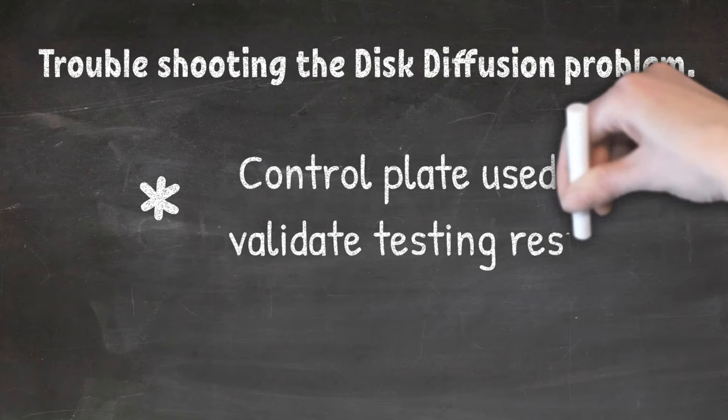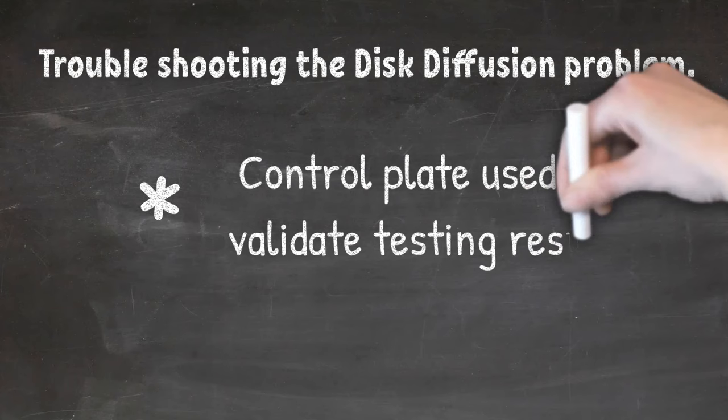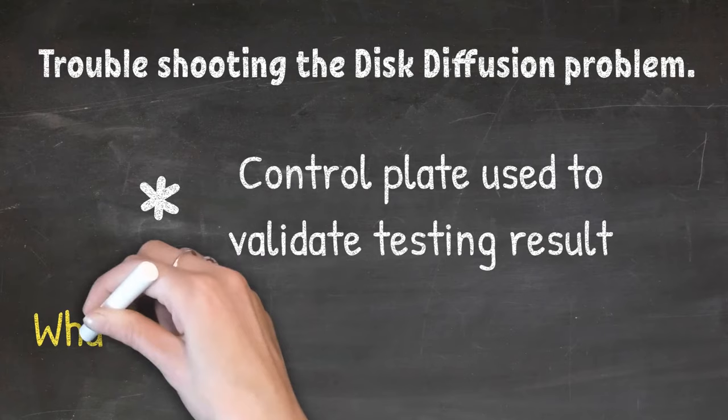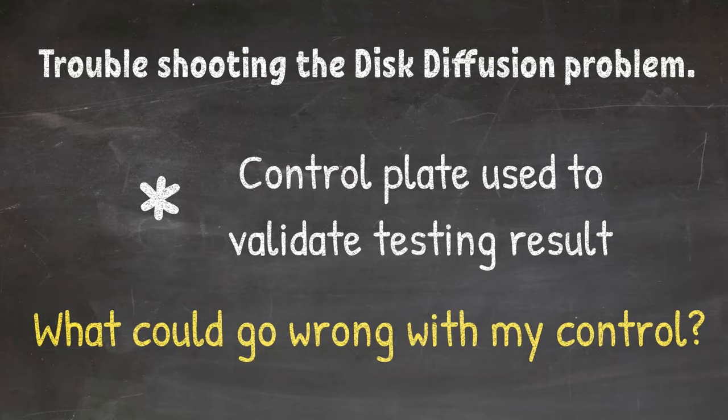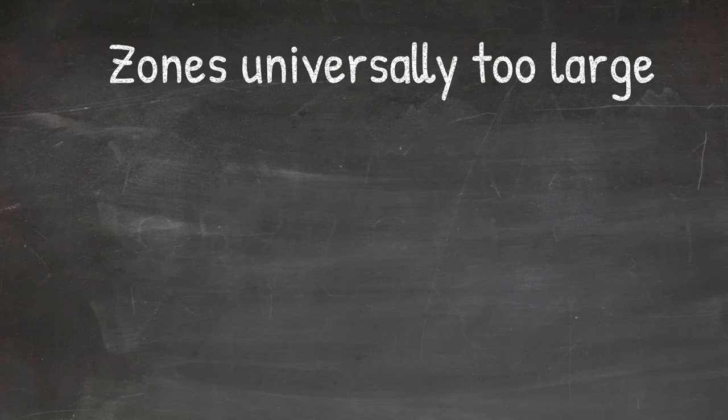Troubleshooting the disc diffusion problems. A control plate is used to make sure that the results are valid. When control fails, there are steps that can be taken to troubleshoot the disc diffusion problem. If the zones are universally too large on control plates, this means you notice that all the antibiotic discs give a larger than normal zone of inhibition. This could mean a few things.